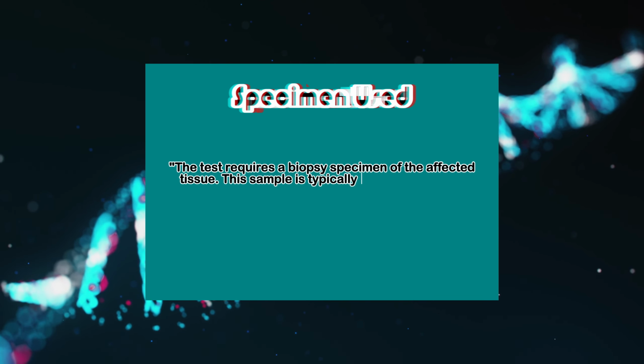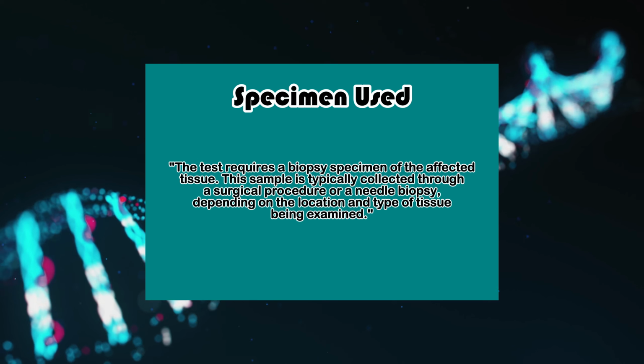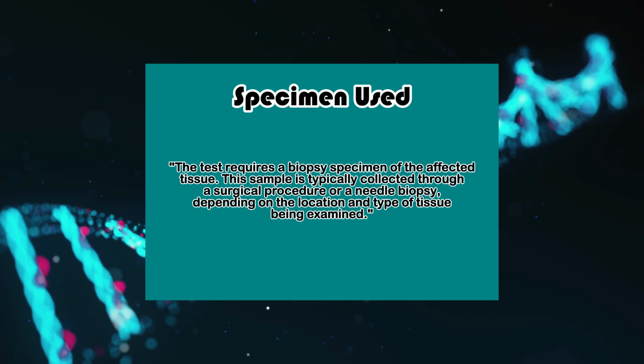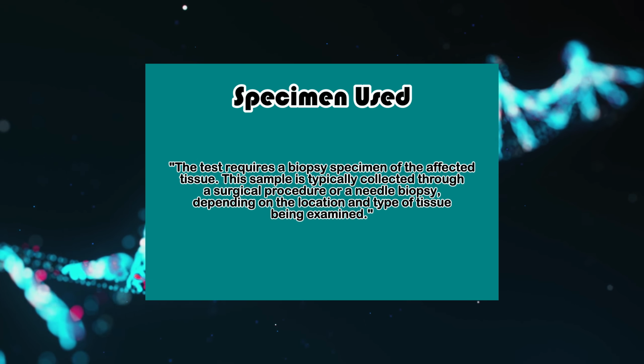Specimen used. The test requires a biopsy specimen of the affected tissue. This sample is typically collected through a surgical procedure or a needle biopsy, depending on the location and type of tissue being examined.